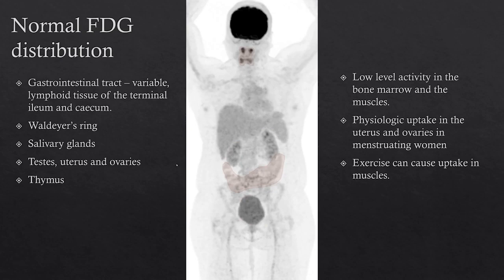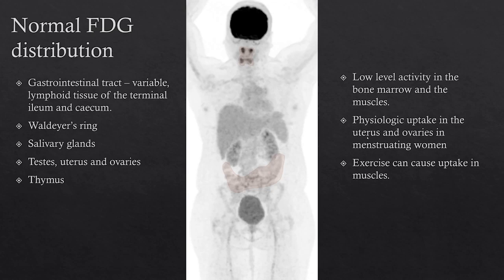Other normal distribution in the gastrointestinal tract can show variable uptake. You can see normal prominent uptake in the lymphoid tissue of the terminal ileum and cecum — when looking at colorectal cancer, it's important not to call that malignancy. If patients with diabetes are taking metformin, you can see prominent uptake in the intestines. You can also see uptake in Waldeyer's ring, salivary glands, testes, uterus, ovaries, and the thymus in younger patients. For the uterus and ovaries, this is typically seen in menstruating women and is physiologic.